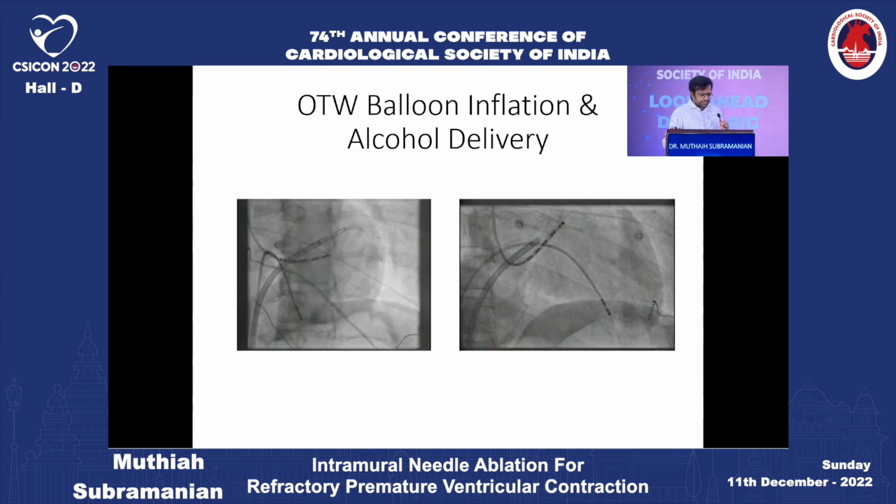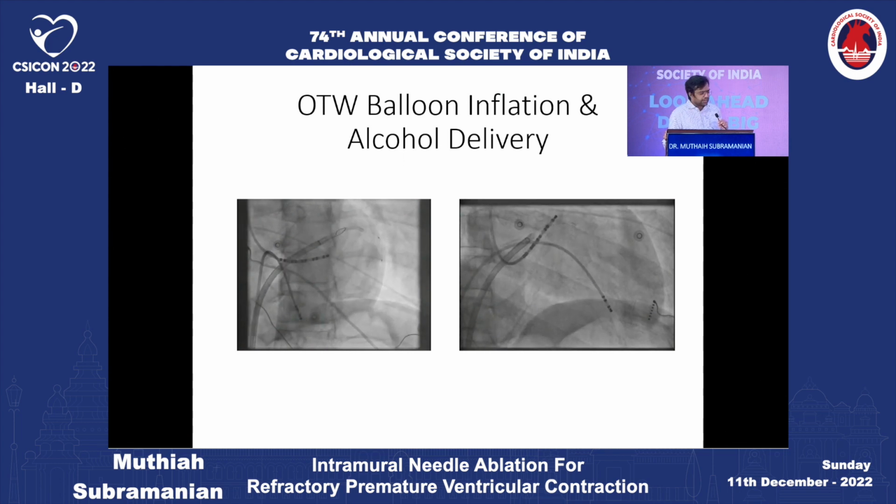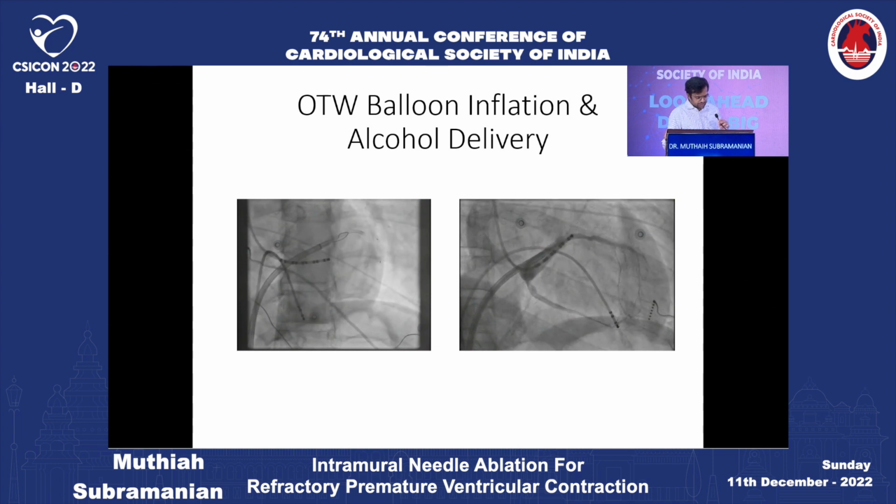The other thing to keep in mind is that this is done through an over-the-wire balloon. The reason we use an over-the-wire balloon is that you don't want too much backspill of alcohol when you're delivering the alcohol. Can you play the video for me? So you will inflate the balloon and then deliver the alcohol, and you can see a little bit of staining that has occurred in that vein after the alcohol has been instilled.